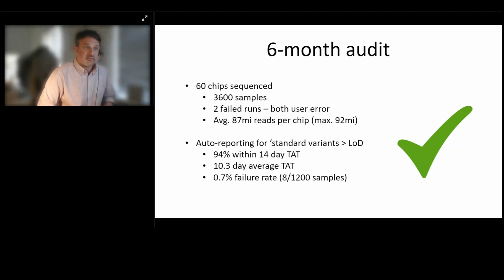So that's from the sample being received in the lab. And if you contrast this to the previous standard of care, where we had disparate turnaround times, and some places had an average of 21 days, this is a significant improvement for us.